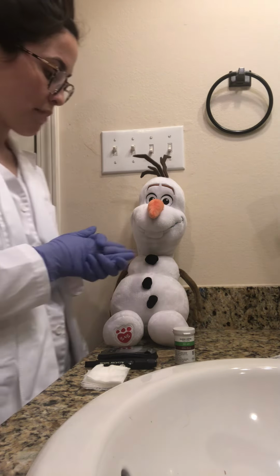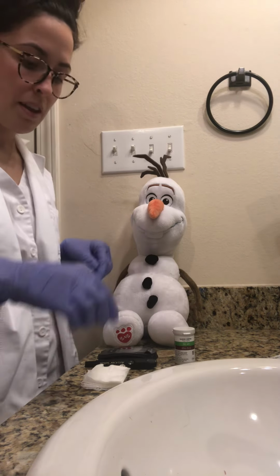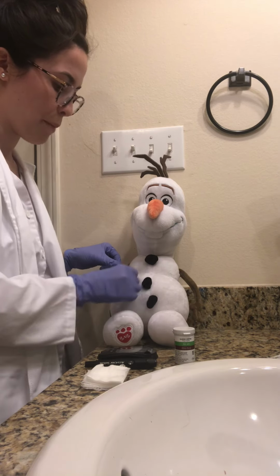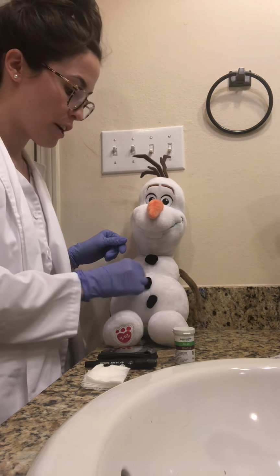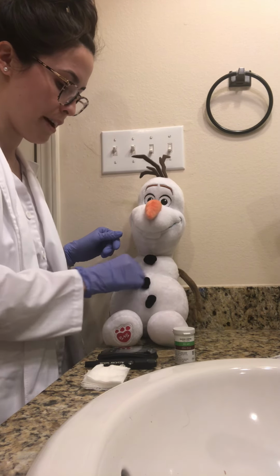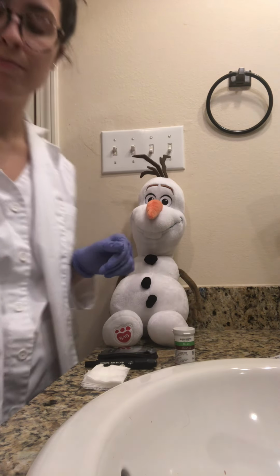So, like Mr. Olaf said, he did his left abdomen last, so we're going to rotate to the right side, and we're just going to get an alcohol swab and wipe in a circular motion here. Be sure to, like I said, use friction just to rid the area of any kind of bacteria that might be there. All right, and we're going to allow that to dry completely while we get the syringe.